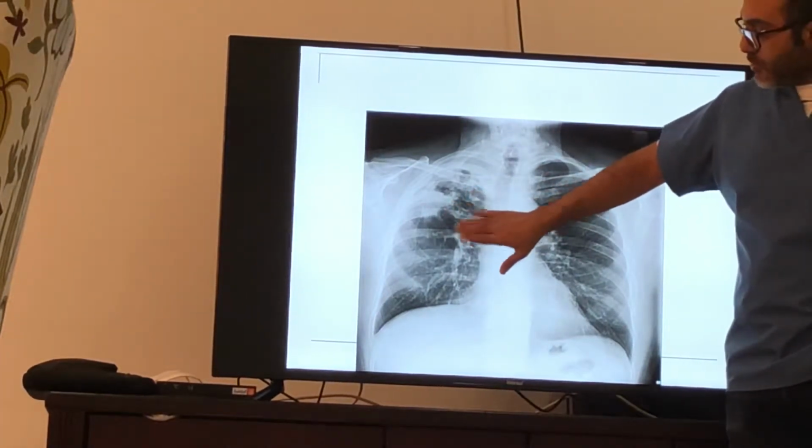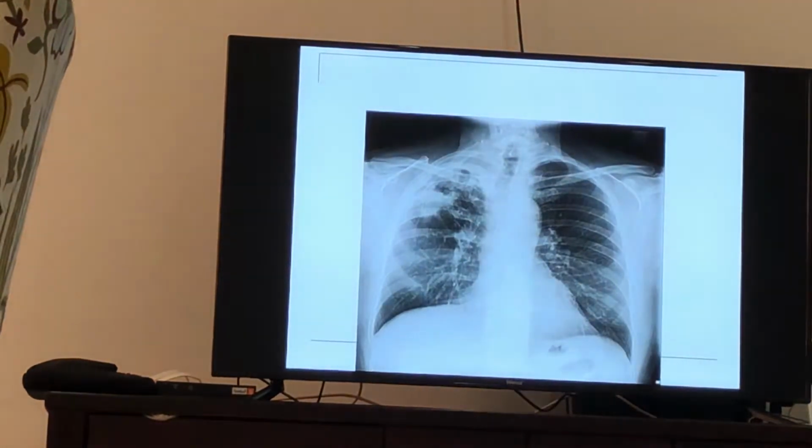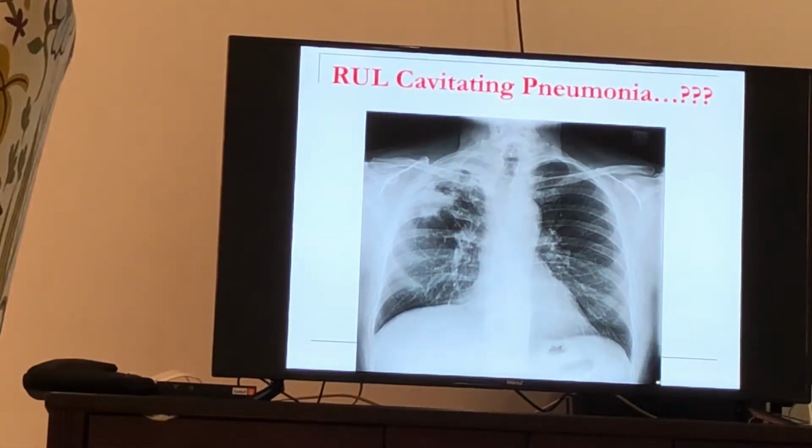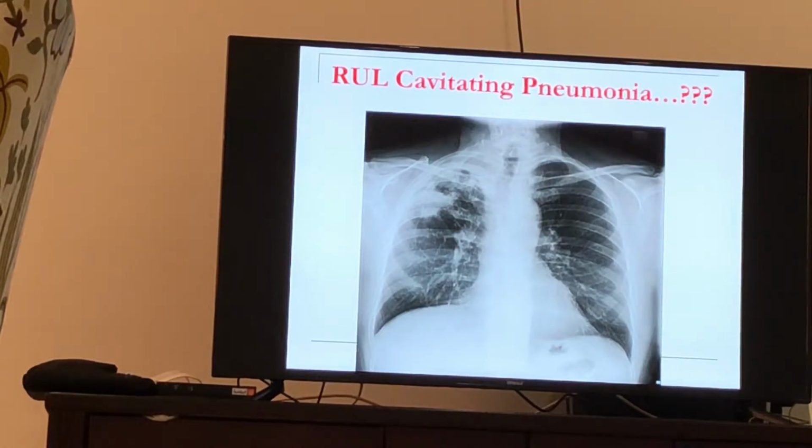Okay, so it's not the normal lung. This is consolidation with breakdown. This happens with what types of pneumonias? Necrotizing pneumonias. Yeah, necrotizing pneumonias. So usually, if you're having a cavitating pneumonia, you think of necrotizing pneumonia or TB. It turned out to be TB, right? Still negative here.